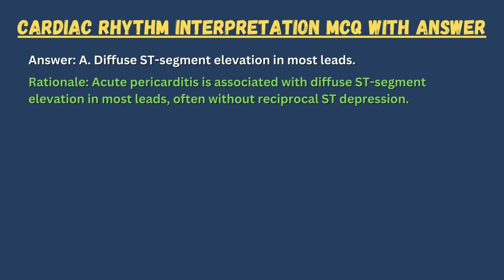Answer: A. Diffuse ST segment elevation in most leads. Rationale: acute pericarditis is associated with diffuse ST segment elevation in most leads, often without reciprocal ST depression.